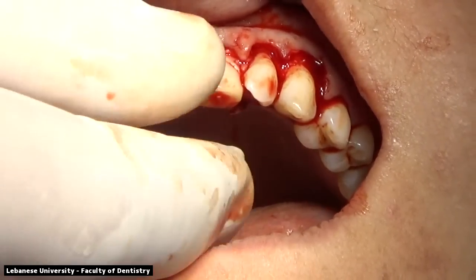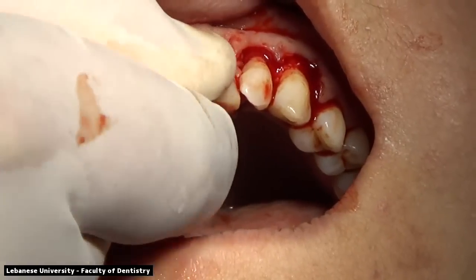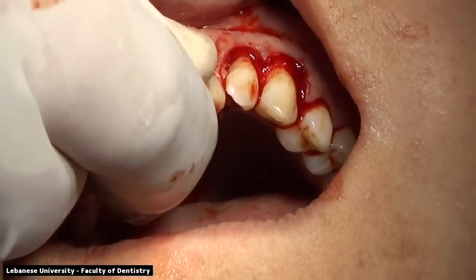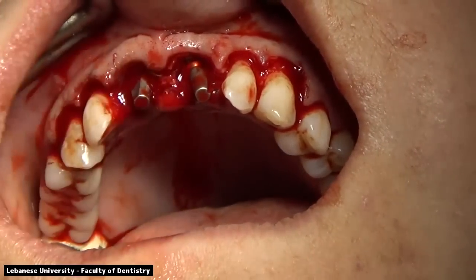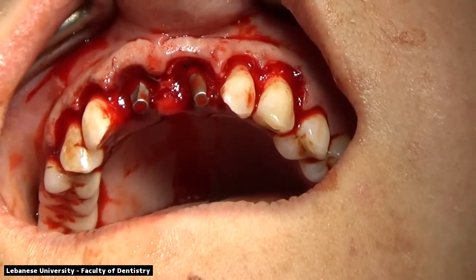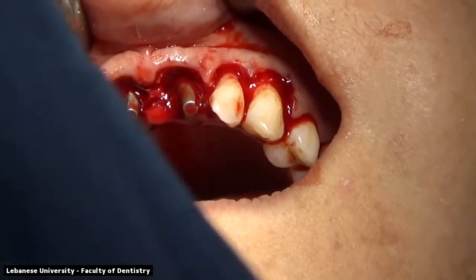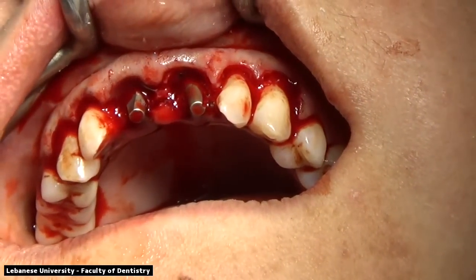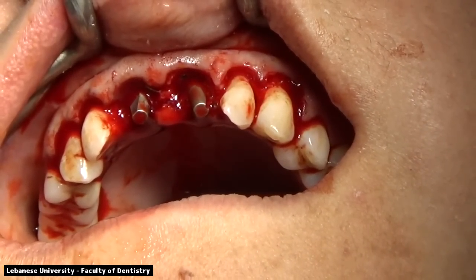So we're making sure it's adapted to both the buccal and the palatal aspect, and that there are no gaps or no ledges or overextension of our provisional restorations beyond the margins of the abutment itself. Any extension of the restoration might lead to bone resorption, and bone resorption during the healing process will be detrimental to our case.